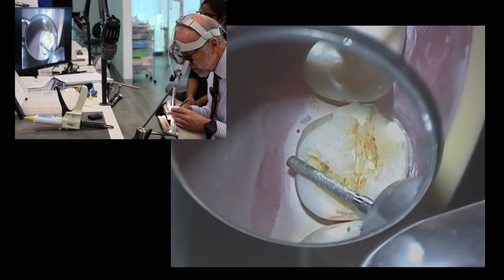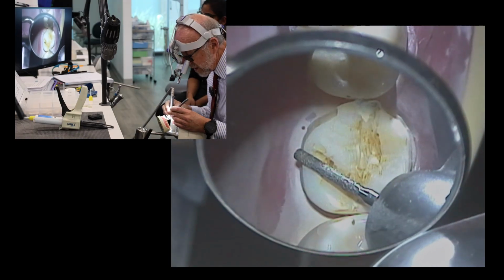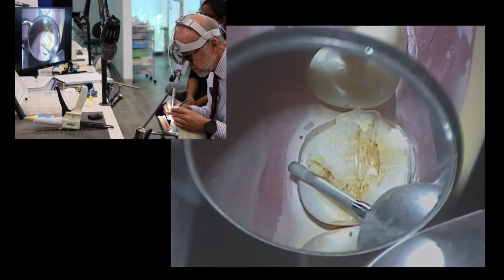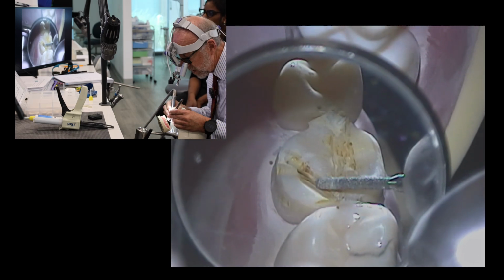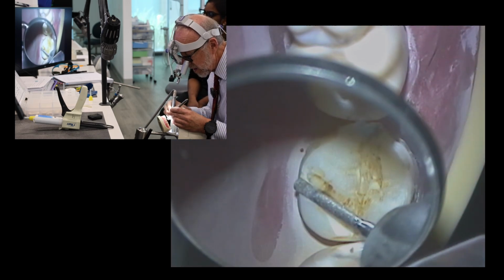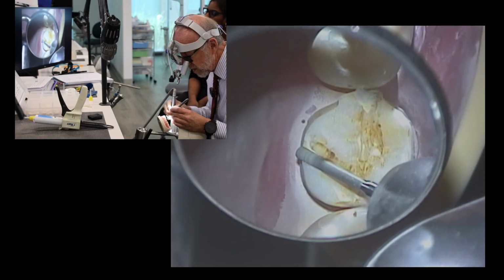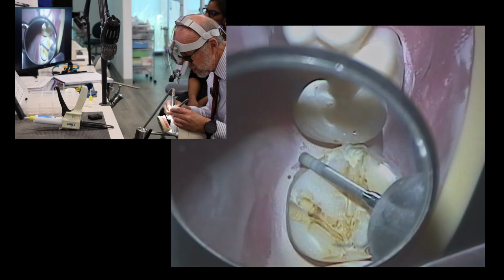Now when you do the C-plane, point the burr this way. Remember what I said? You've got to be looking down the axis in the mirror. Then you can see the direction you're pointing the burr and make a nice groove right there. So the distal lingual groove comes up the B plane like this and then down the C plane like that. As long as you have the burr pointing in the right direction diagonally, then you can keep it pointing that direction all the way around here.